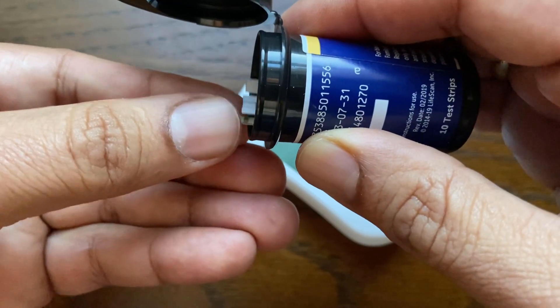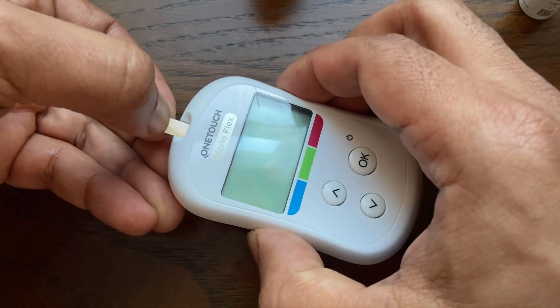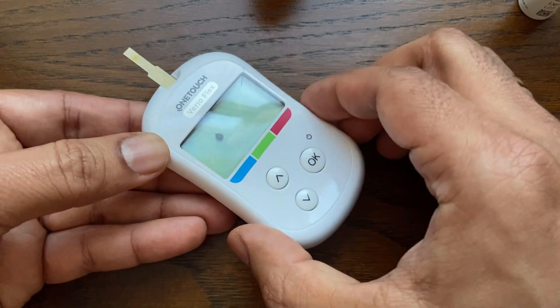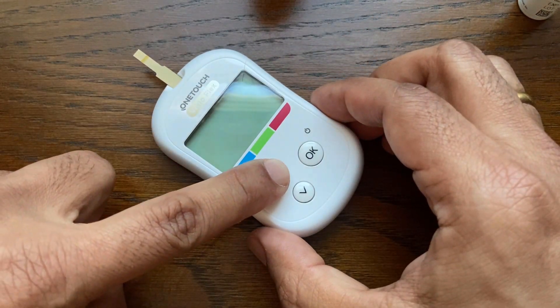Take a test strip out of the bottle and insert the test strip into the meter's test strip port. With the flashing blood sample symbol blinking on the display, press and hold the arrow button until the control solution icon appears on the display.